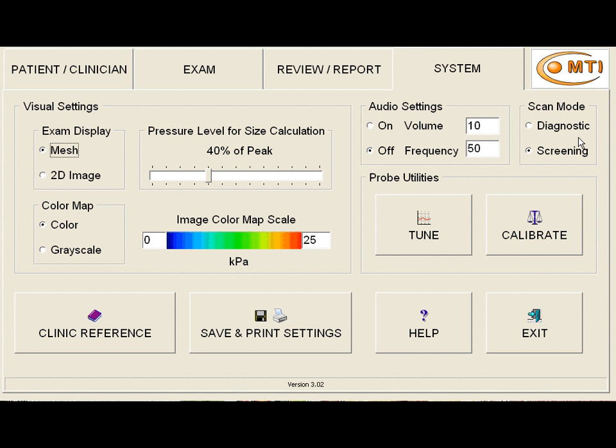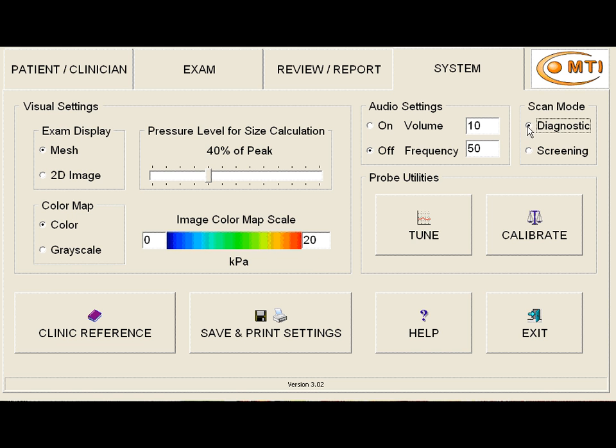And this particular scanner has a screening and a diagnostic mode. And we note that in the screening mode, the maximal pressure is 25. And we click on the diagnostic mode, and we find that the maximal pressure went down to 20.